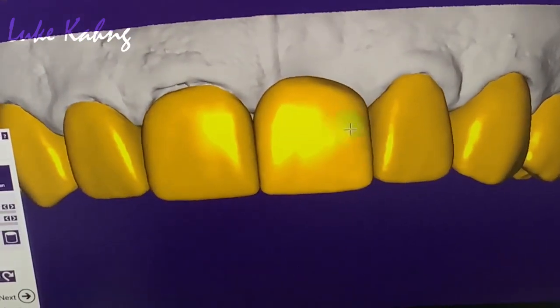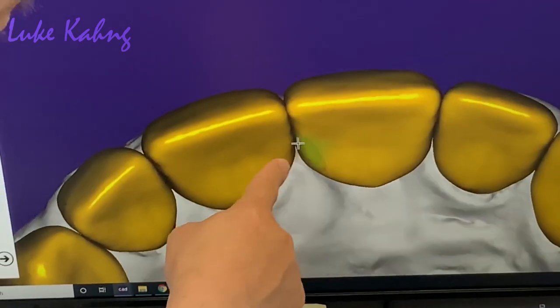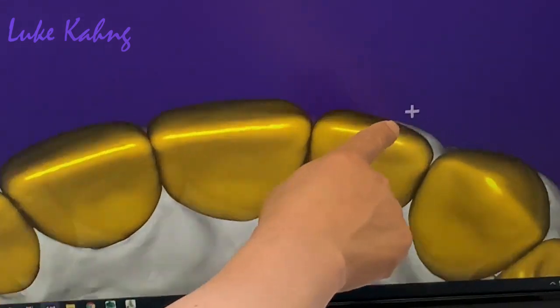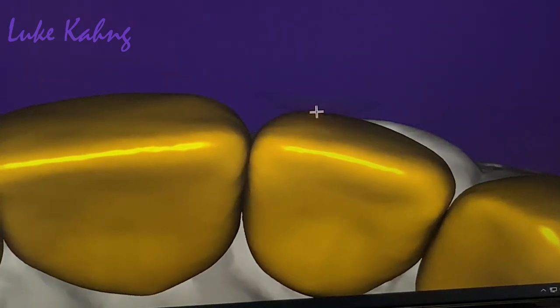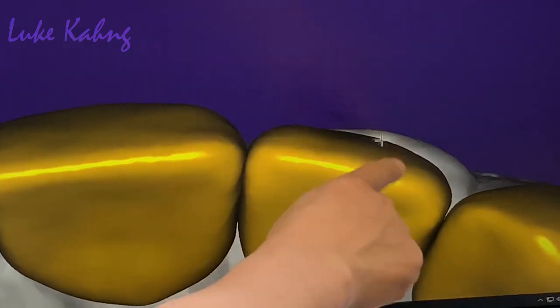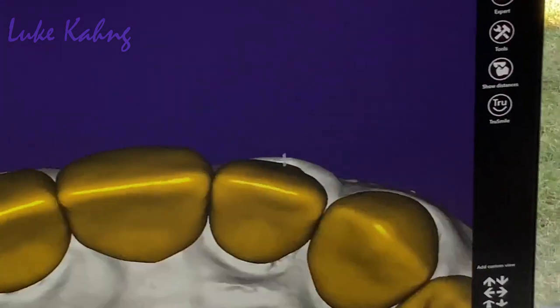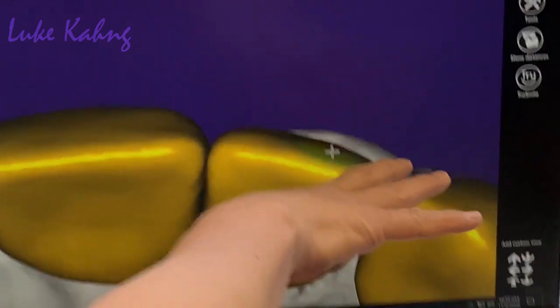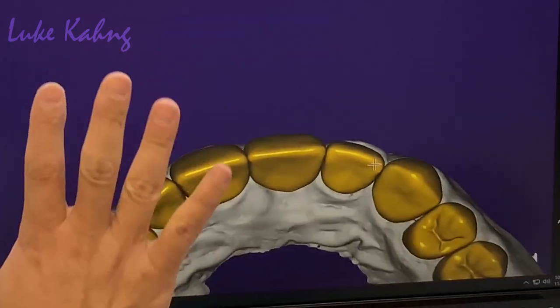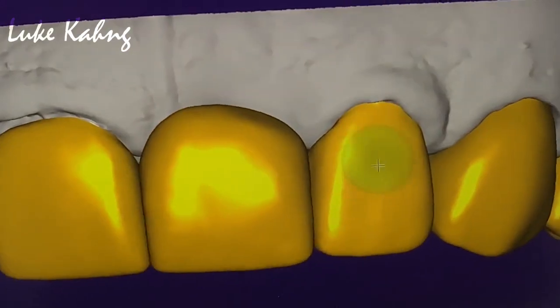You see here? Now, this three unit bridge? Yeah. Okay, occlusion view. So, I like this. You can make it a little more thicker only here, later. I'm okay later. Okay, now this is sticking out, bring it in. Yeah, facially bring it in like this. Everything distal to distal here. Cut it. Alright, I don't mind if you change like this. Yep, frontal view. Now too flat, make it slightly. I need that.